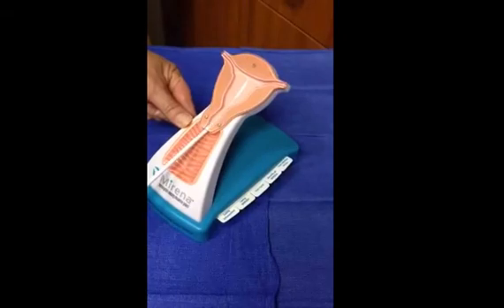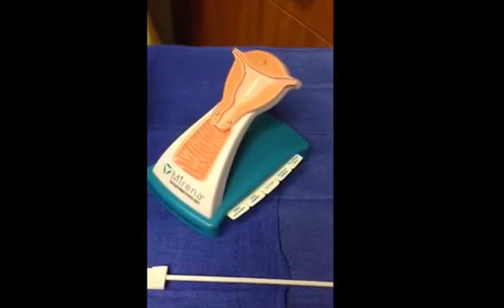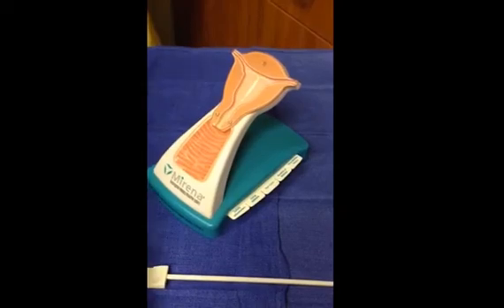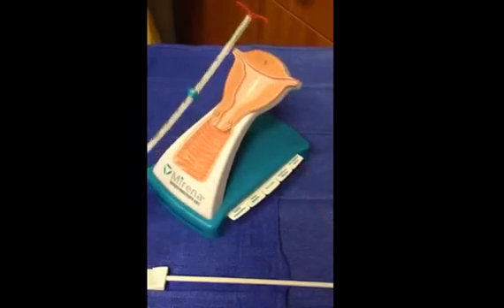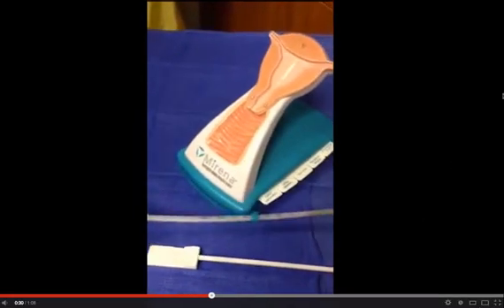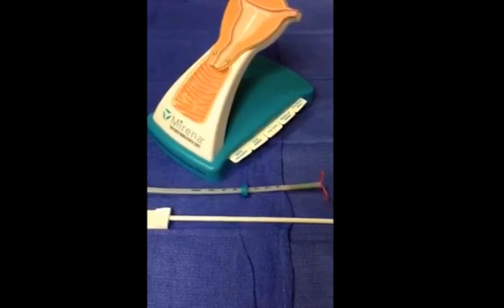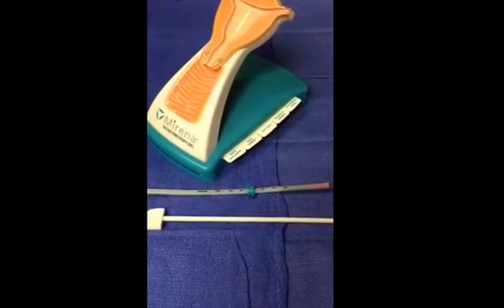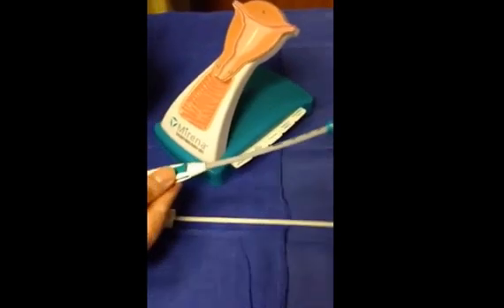Sound the uterine cavity, then assemble the device. Insert the device to the fundus of the uterus and pull back approximately one to two centimeters. Deploy the device and wait approximately ten seconds. Remove the applicator and trim the string three to four centimeters from the cervical os. Remove the tenaculum and apply silver nitrate if needed.